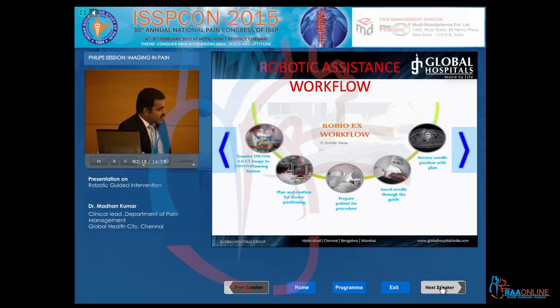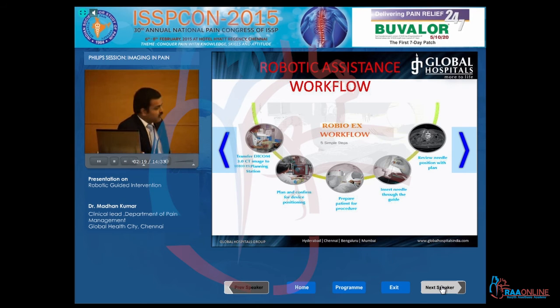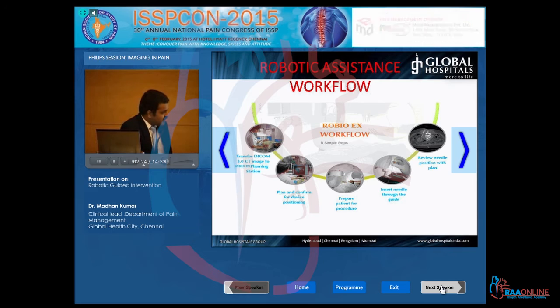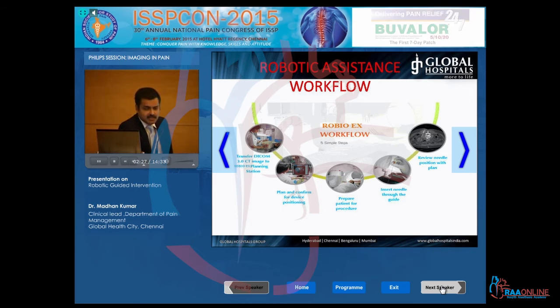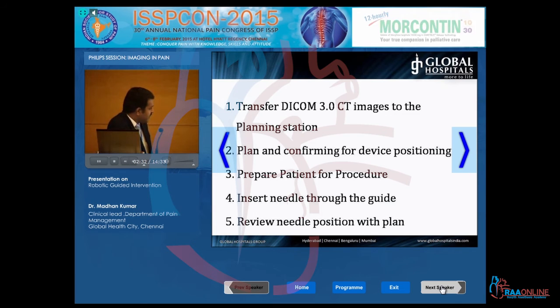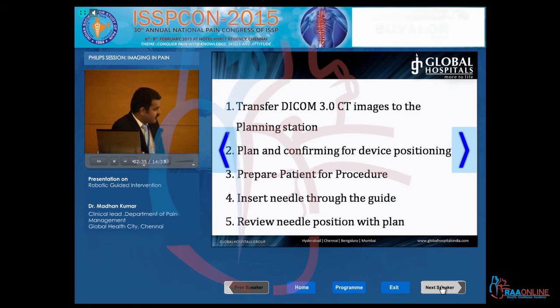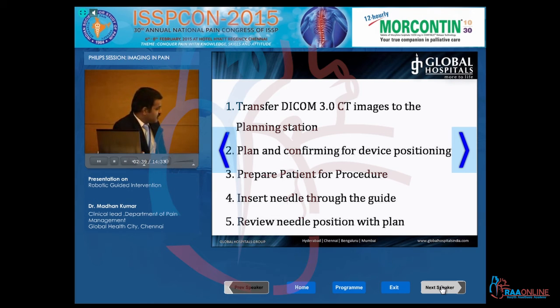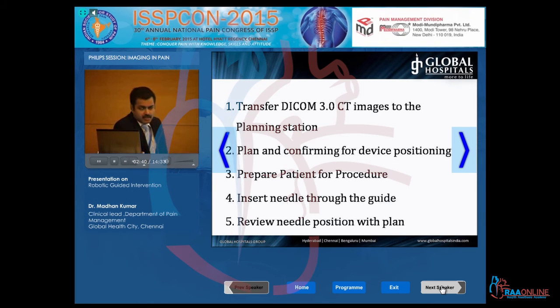I got very concerned about this cannulation procedure. I don't do a repeat scan, but there is always a review plan where we check that the needle is in the right position. So we transfer the image, plan and confirm the device positioning, prepare the patient for the procedure, insert the needle, and review the needle position against the plan.